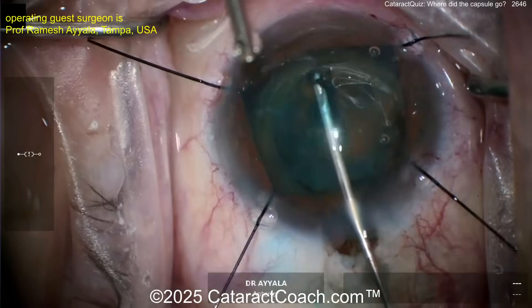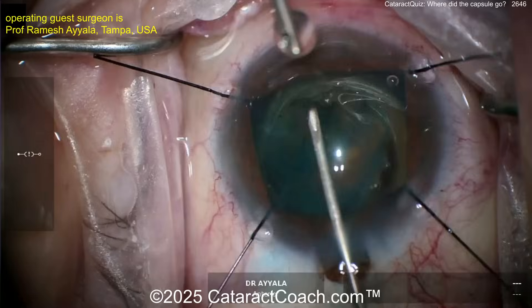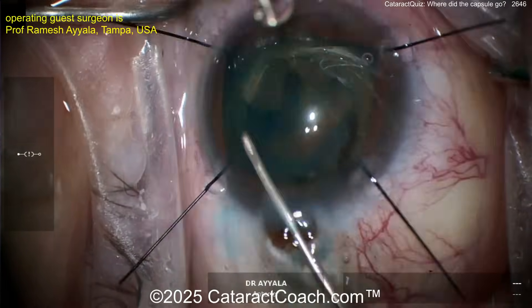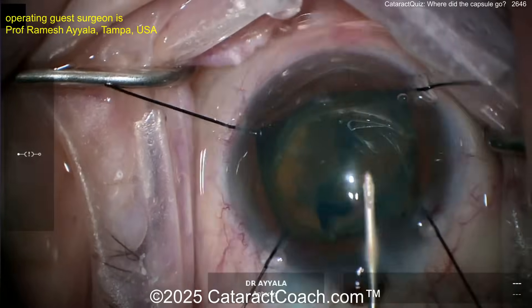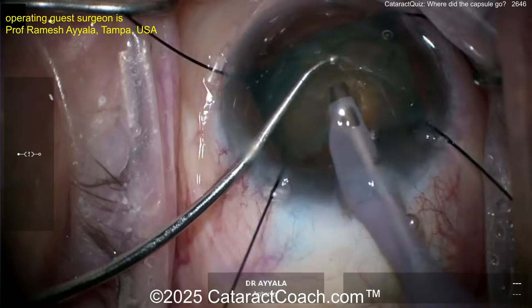Let's get that rhexis going. We sped the video up — you guys like that so we can get through the case efficiently. Maybe even having to use the cystotome to just poke in and do a little bit of a can-opener technique. Sometimes with these fibrotic lenses you have to do that, and that's okay.